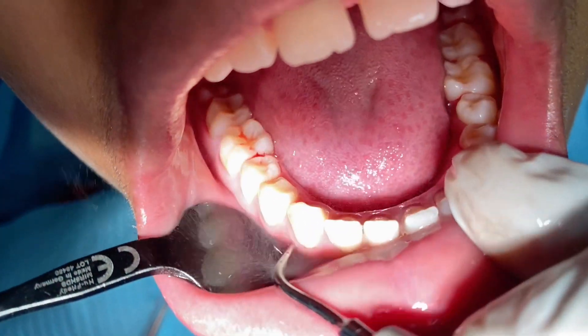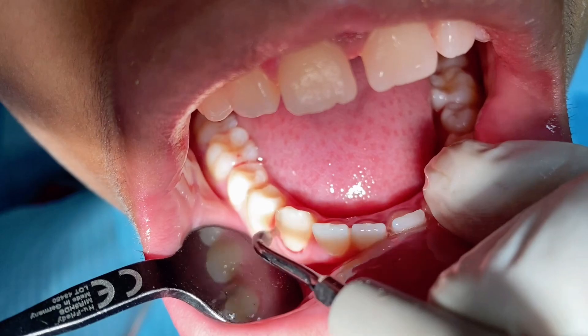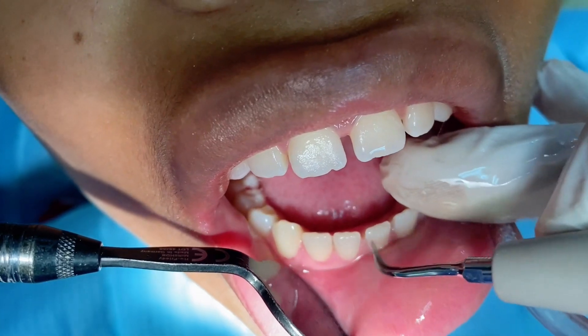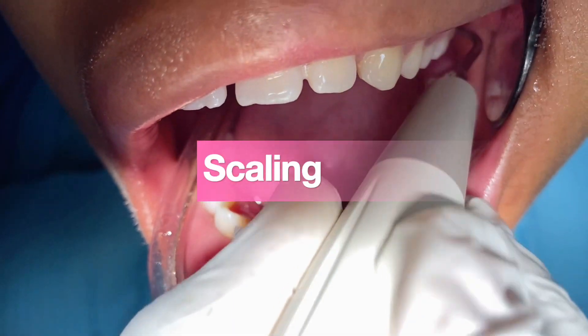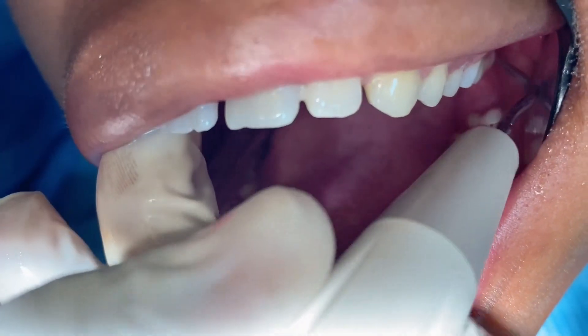The instrument used for this treatment is usually an ultrasonic scaler, similar to a regular hand scaler. However, this one has water coming out of the tip, which helps to clean out the scaled plaque, tartar, and stain, as well as make it easier to work around the surfaces. These scaling tools can be called either piezo or cavitrons, depending on the vibration.